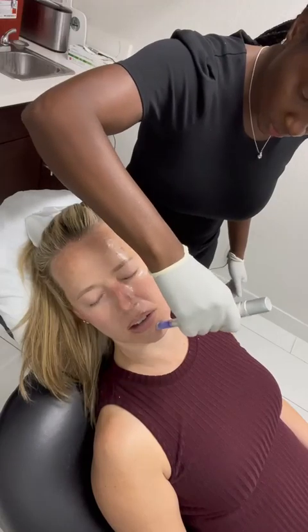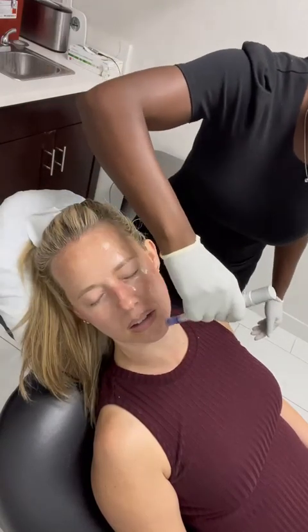This pen stays charged during my entire microneedling PRP procedures with no complications. It's easy to clean and keep sterile after every use. I also use the centrifuge to create plasma to inject under the client's eye — performing PRP under the eye to clear out dark circles and smooth out color discoloration under the eyes.